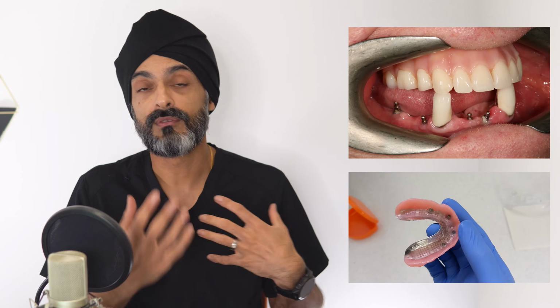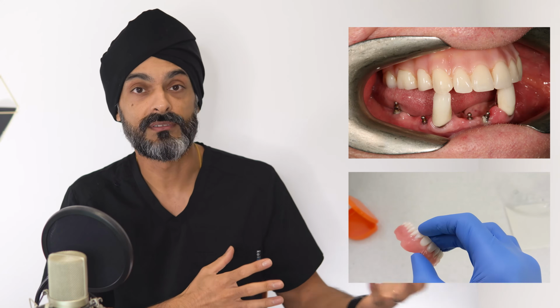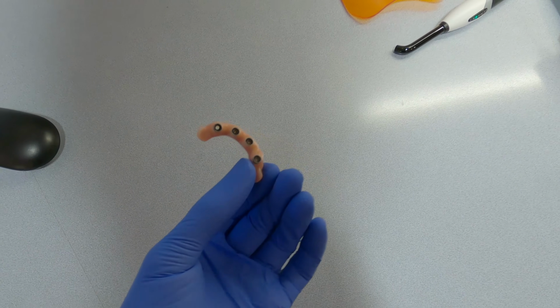Okay, I read this and I thought, you know what? You are right, but there's a number of reasons why we talk about aesthetics first. So I will talk about the different solutions: a removable partial denture with zero implants, and mini implants or locator dentures, so teeth which you can click in and out depending on whether you have mini implants or normal implants. And then we'll look at the full fixed solutions.